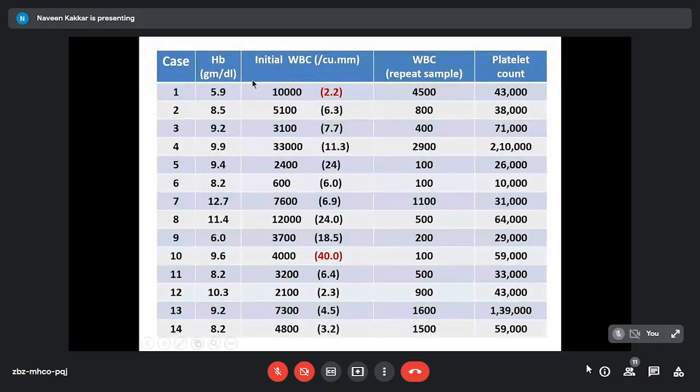Those are the counts that I'm showing you. That's hemoglobin and platelet. You can ignore that. But look at the initial WBC count, leukopenic to normal to high counts. But look at our repeat samples, markedly leukopenic. This was actually the actual count. This was falsely high. And the number in brackets is the number of times it was more than the actual count. So almost 40 times higher than the actual count, which was 100 in this patient. So we reported 14 falsely high WBCs in the first go, and then on repeat samples, they were much lower, much lower.